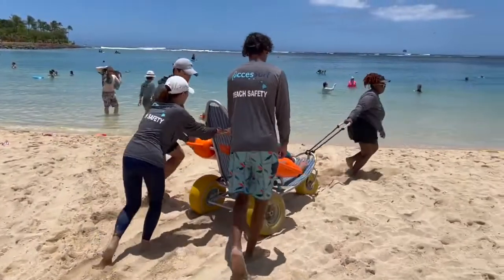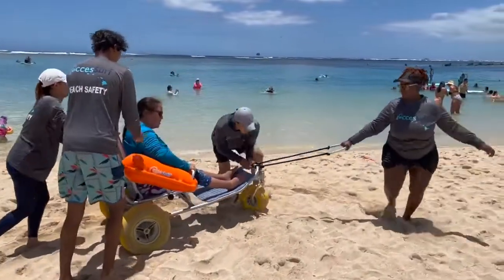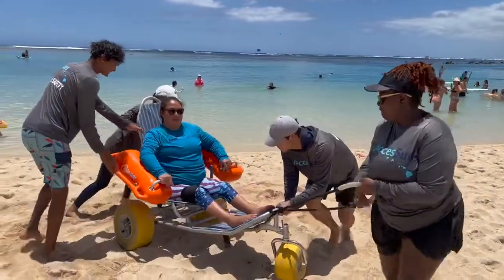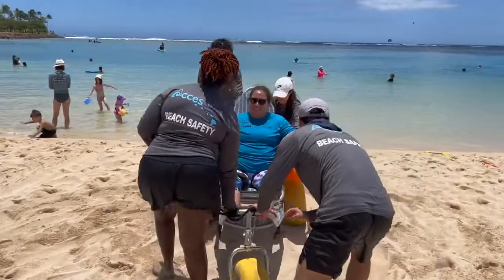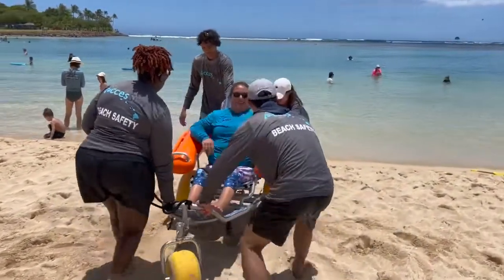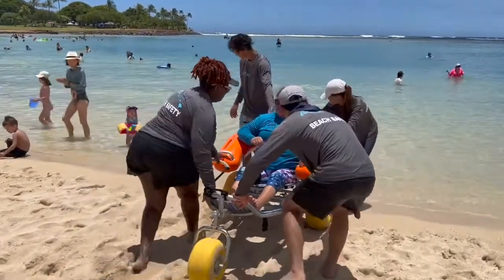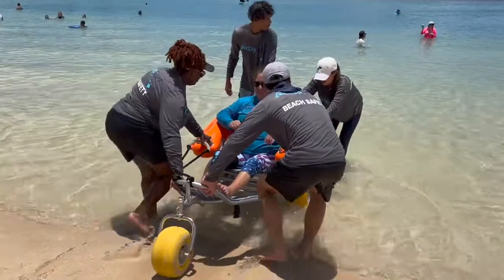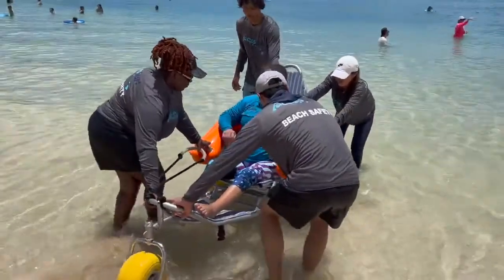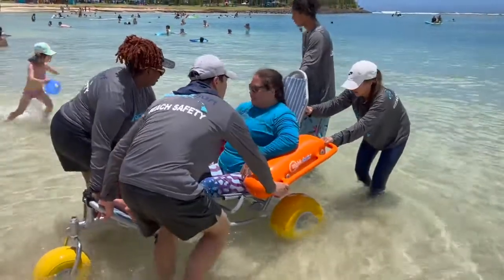When approaching the water, the Mobi-chair should be turned 180 degrees so the back is facing the water, as the chair should enter backwards and perpendicular to the shoreline. The team leader should give the participant updates as needed and check on the participant regularly, especially when moving the chair backwards. For example, as the chair enters the water, the team leader should inform the participant when they are about to make contact with the water, when larger waves are about to make contact with them, and if there are any drops in the sand.